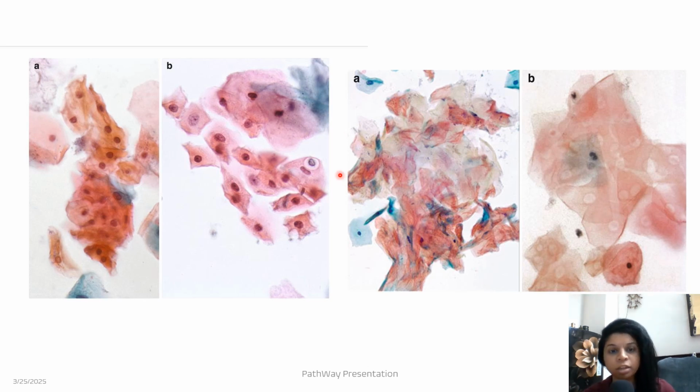Usually in the keratin layer you won't get a nucleus, and when there is a nucleus in the keratin layer, then it is called parakeratosis. So how you identify parakeratosis is that, see, there is very orangeophilic cytoplasm, which means it is a keratin layer. So in a keratin layer, if you are seeing the nucleus, then there is more chance that you are seeing a parakeratotic cell. These are just protective or reactive phenomena that you can see in uterine prolapse also.